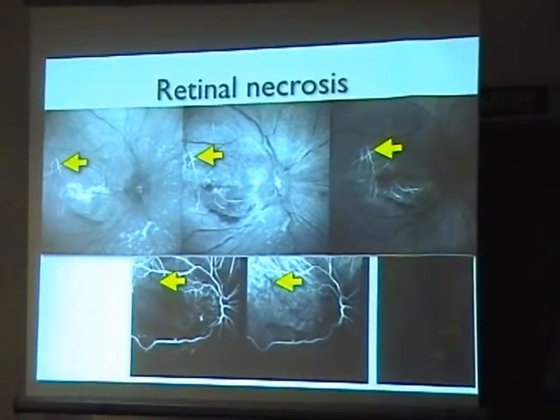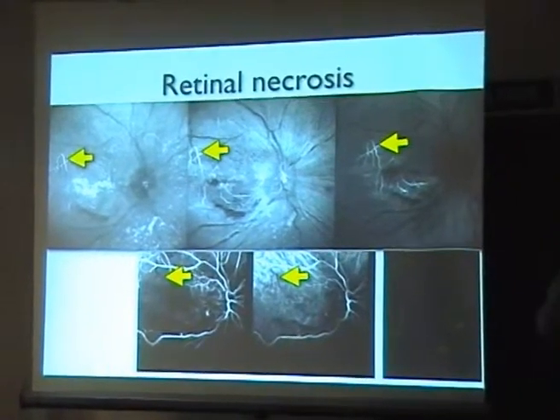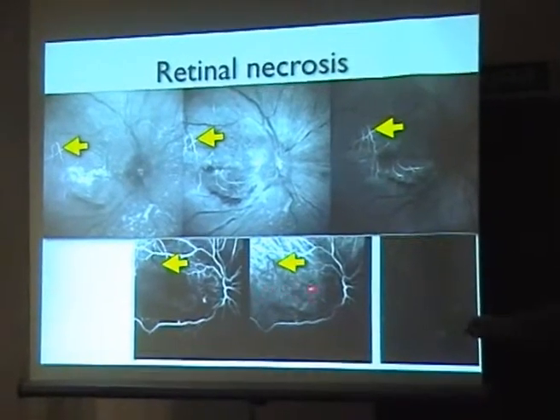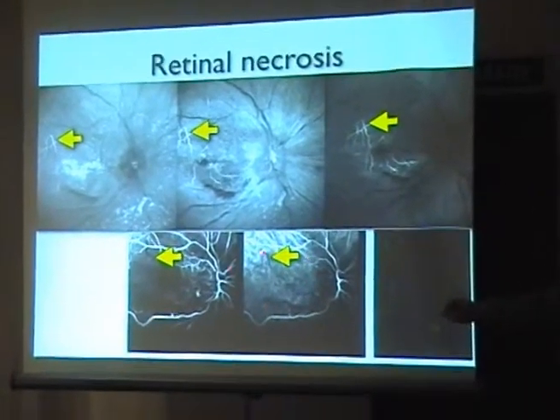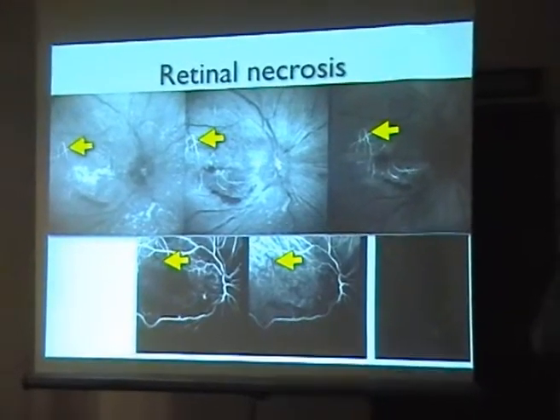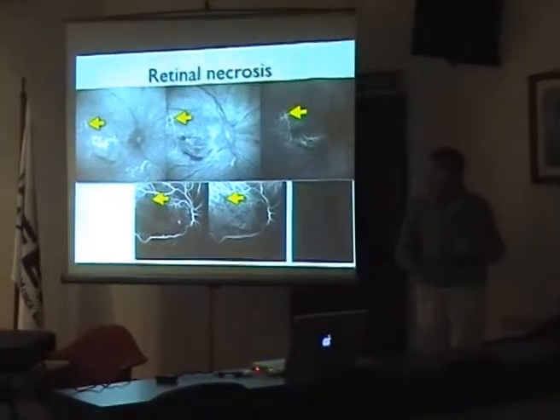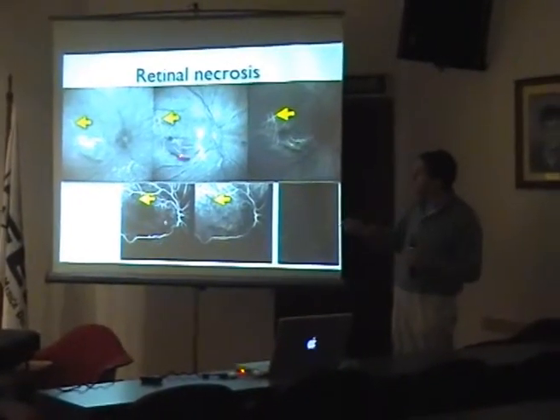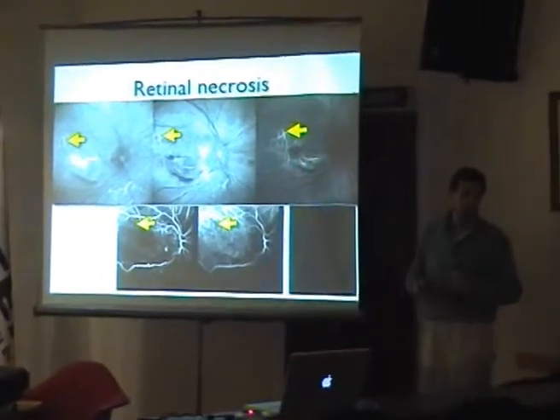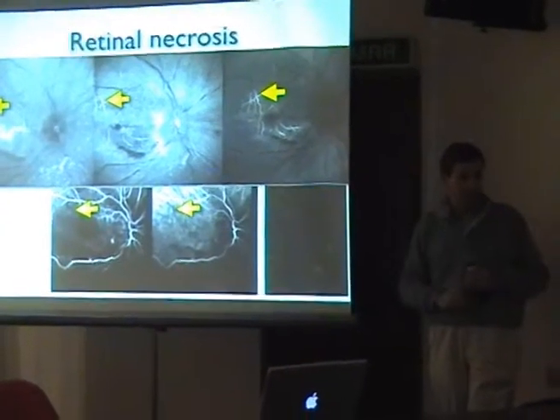But more than that, I think that this is whole blood. We saw that whole blood fluoresces. And you see that there is completely no filling of this vessel. So it means that the vessel has blood completely stopped, and that probably can give this increased autofluorescence. As a matter of fact, 1 year later, this autofluorescence disappeared.